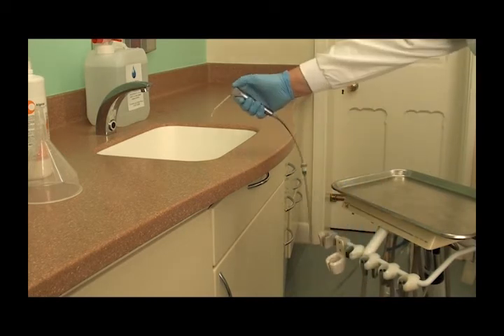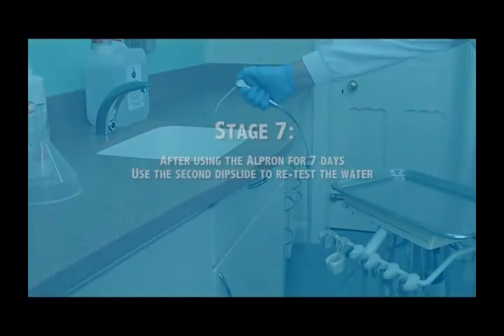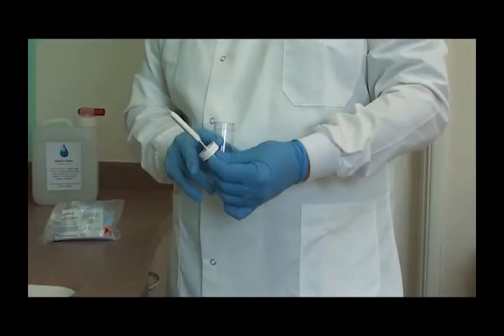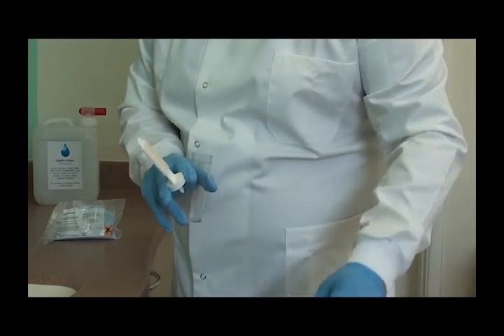Refill the bottle, reattach the multi-flex couplings and hand pieces, and the chair is now ready for use. The success of the biofilm removal can be assessed after 7 days by using the second dip slide. The procedure is exactly the same as with the first one.